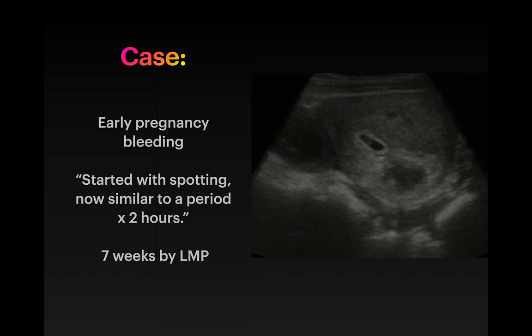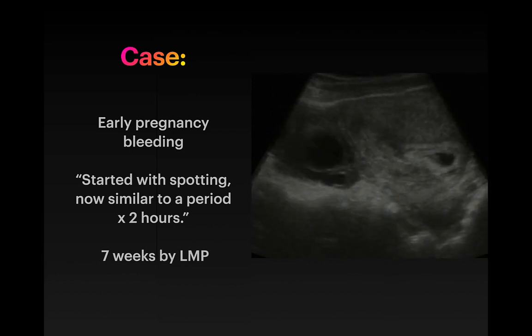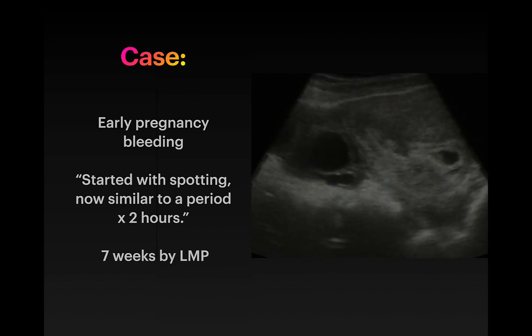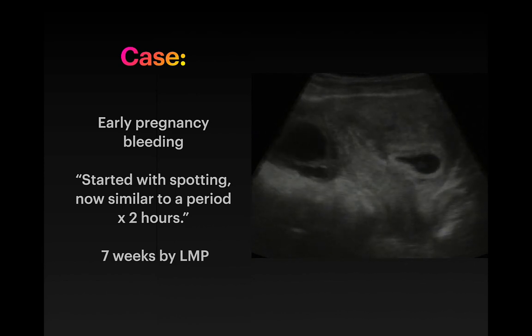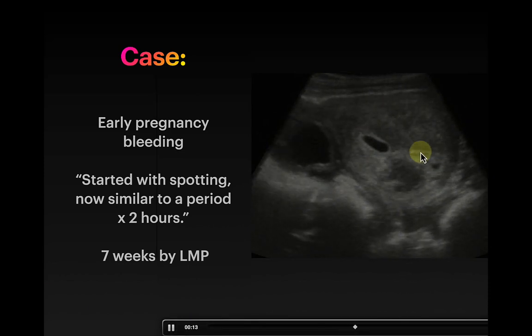All right, last case, early pregnancy bleeding. So patient presents. She has not had an ultrasound yet. She just found out she was pregnant a little bit ago. And this is a transabdominal ultrasound, but you see a big uterus. You see, how many are here? 2. There's lots of circles here. So these two are gestational sacs with little fetal poles in them.